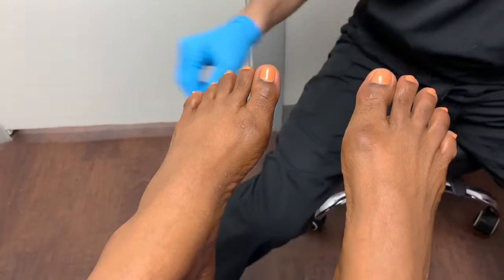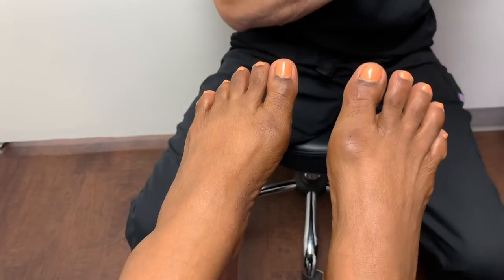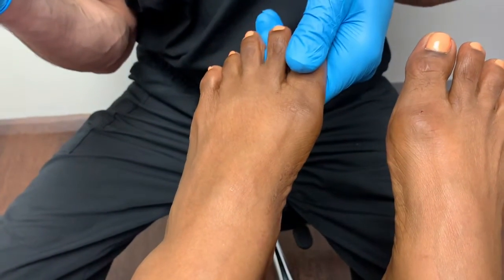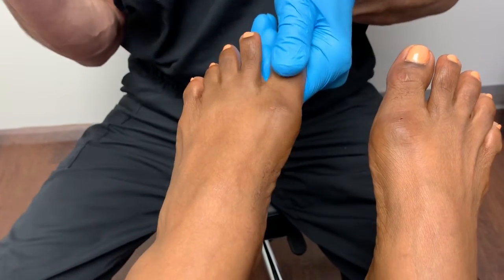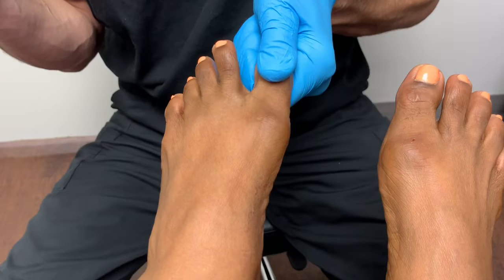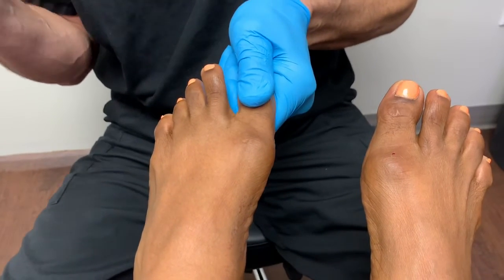The patient — everyone can hear the patient. It's a little uncomfortable. There's a little bit of pressure and a little bit of discomfort. Let's go to the left now. Are you ready? I apologize — this is the worst part of my job. When I do this motion, I feel crackling, like Rice Krispies. That's all the arthritis, which is essentially what Hallux Limitus is — a type of arthritis.